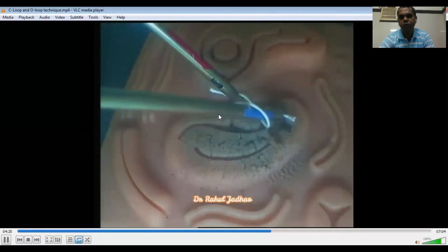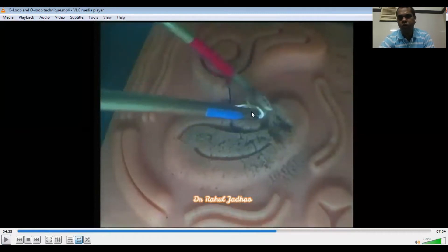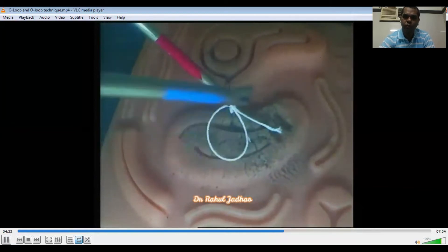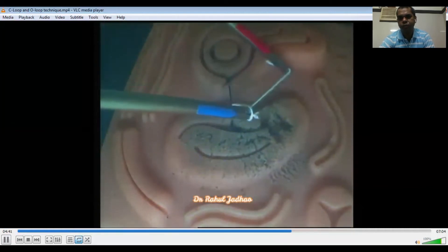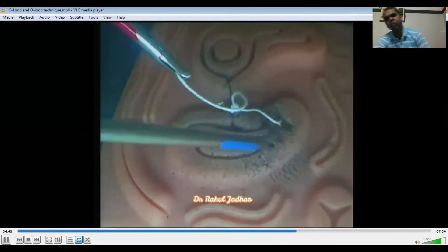The knot is tied with the piston moment. Piston means to-and-fro movements of the right and left needle holder. First we have to go inside with the left needle holder until this knot slides from the tip of the right needle holder, and then we have to again pull back this long tail. We should not pull the short tail. Now again this is the O-loop — now I am demonstrating the over wrap. This is the piston moment of both the needle holders; piston means in-and-out movement of both the needle holders.